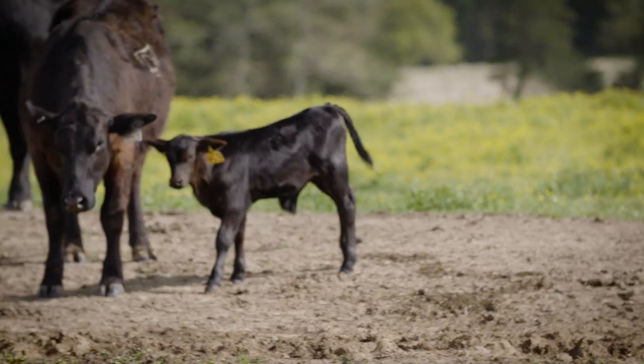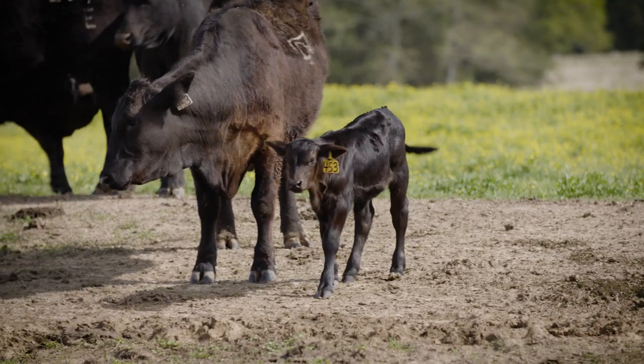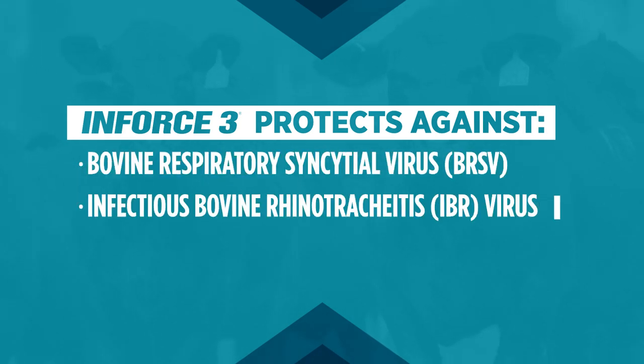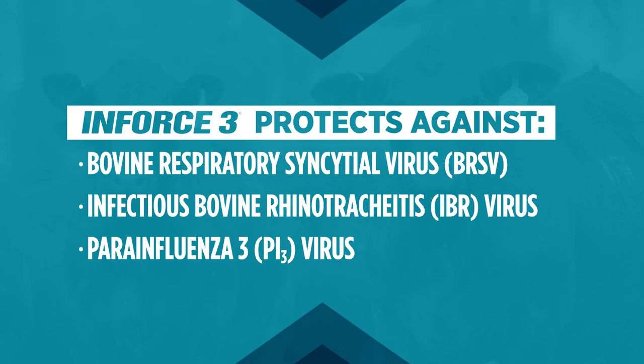It's important for cattle of all ages to be protected against respiratory disease. INFORCE 3 intranasal vaccine protects against three key viral causes of respiratory disease. Proper administration is the first step in effective protection.